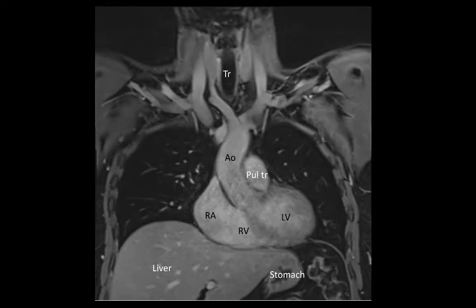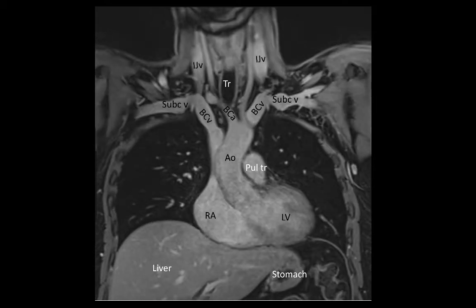The divisions of the major veins of the heart are now in view. Here we see the left and right brachiocephalic veins, which are formed from the internal jugular veins and the subclavian veins at the venous angles. The brachiocephalic trunk is also visible emerging from the arch of the aorta. In this view we can see the left and right common carotid arteries. We can also see the superior vena cava being formed from the right and left brachiocephalic veins.